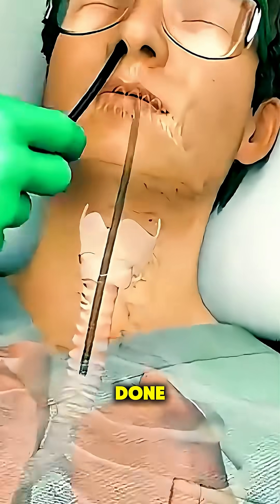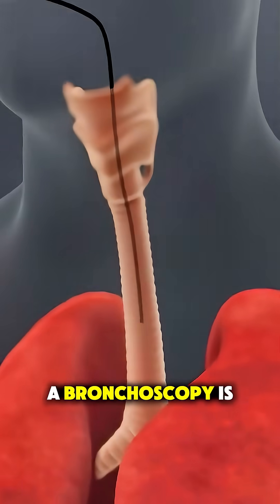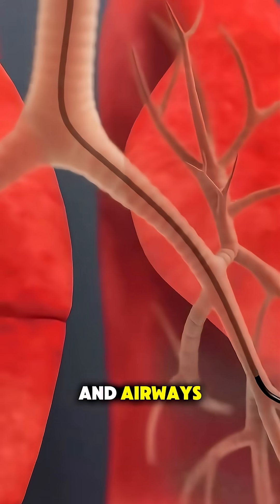Ever wondered how a bronchoscopy is done? Let's break it down in 70 seconds. A bronchoscopy is a procedure doctors use to look inside your lungs and airways.